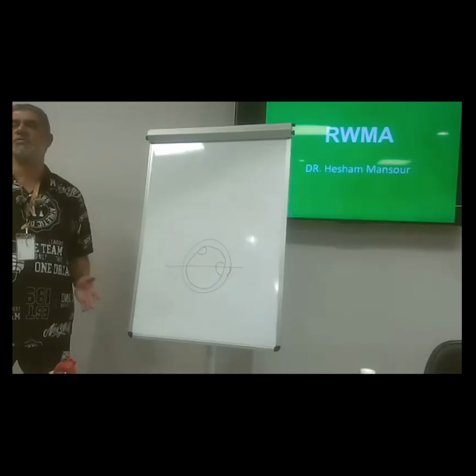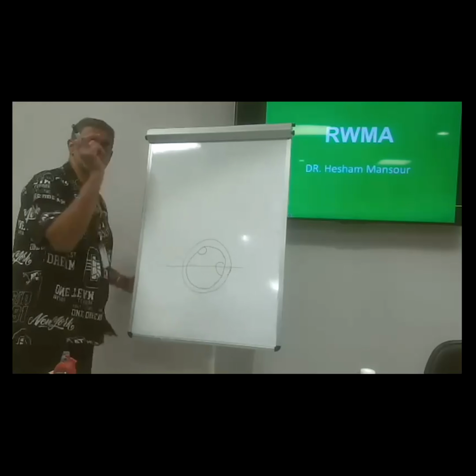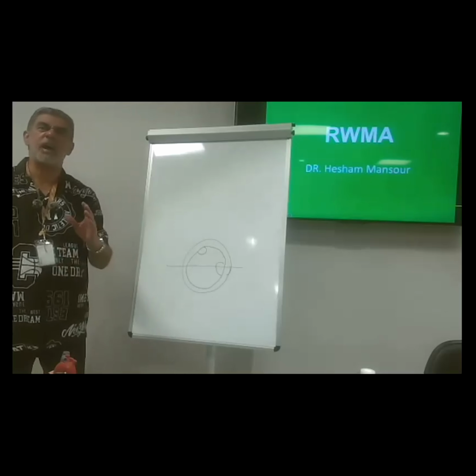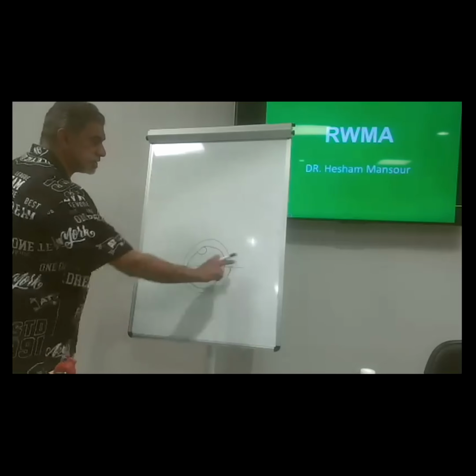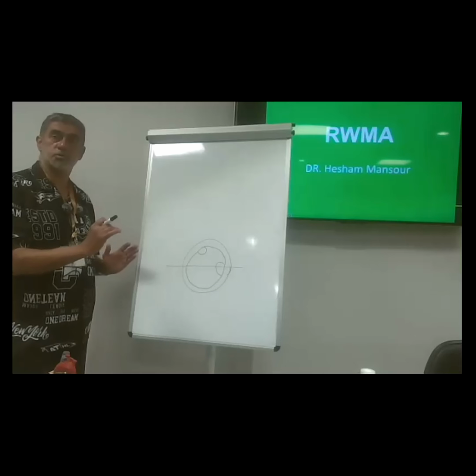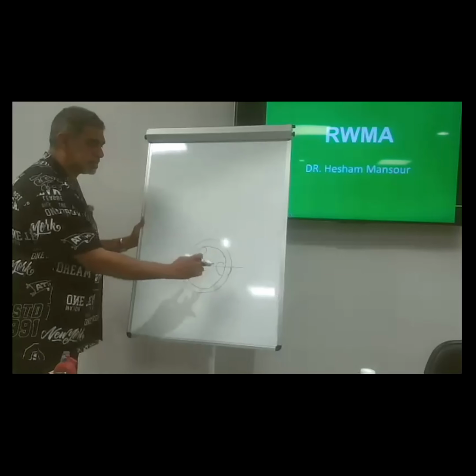Don't sophisticate it. Make it only at this time, and believe me, you got more than 90% of the story. Okay? So this is the mid papillary transgastric short axis view. This is the inferior, this is the anterior.